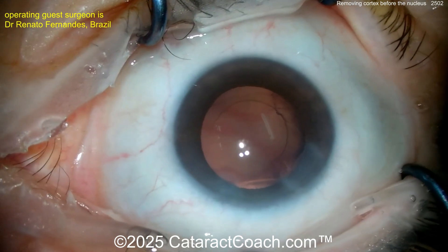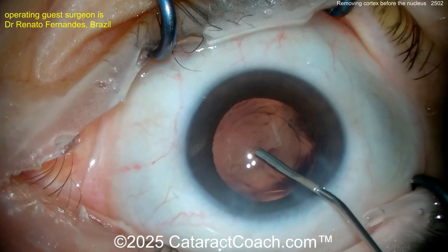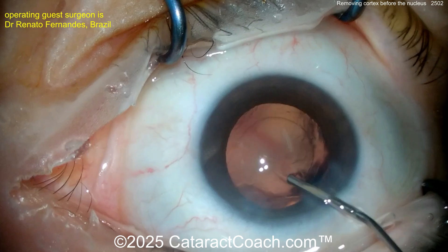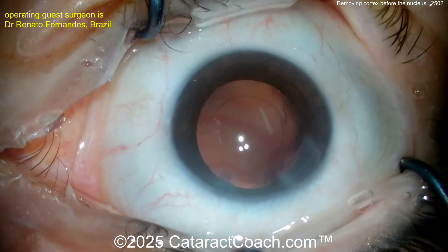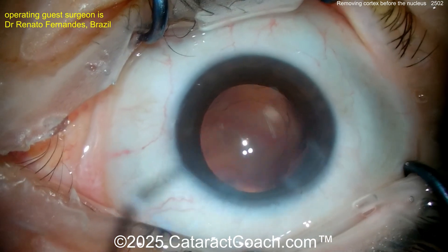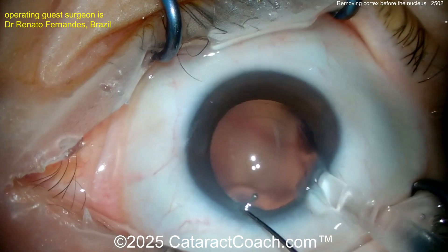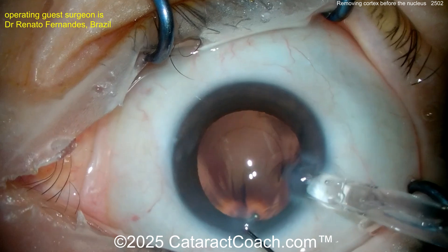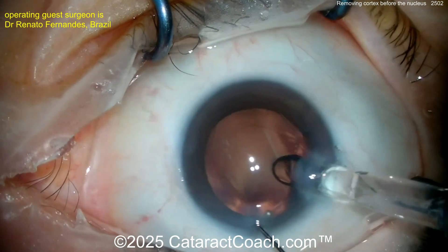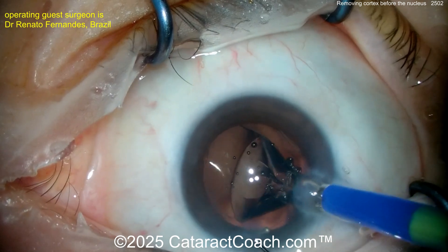I think you can get that remaining cortex out after you put the IOL in. Here comes some viscoelastic to fill up the capsular bag. Always looking to make surgery more efficient so you can help more patients — it's not about speed, it's about efficiency. If you've done fewer than 500 cases, don't worry about that; just focus on being safe. Here comes the lens going into the capsular bag.